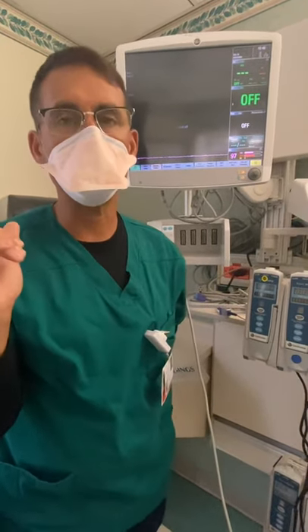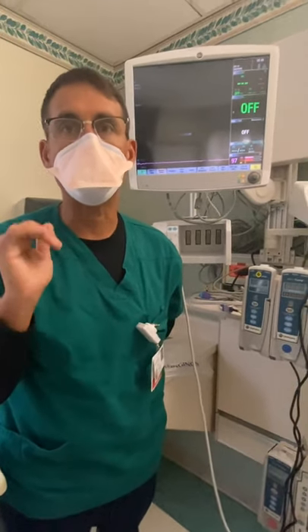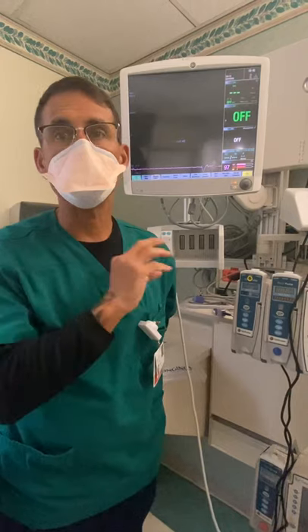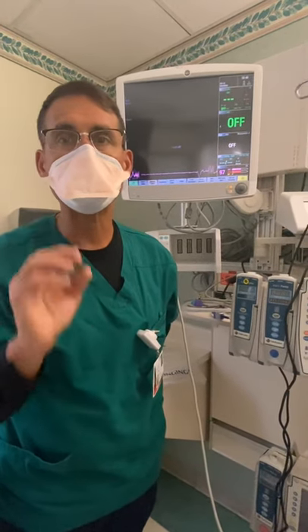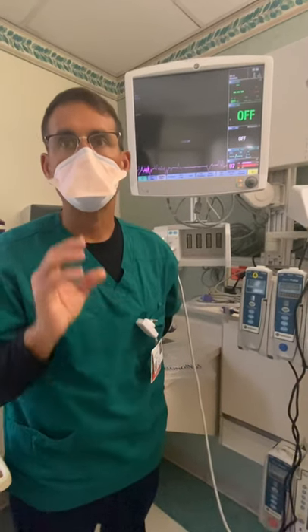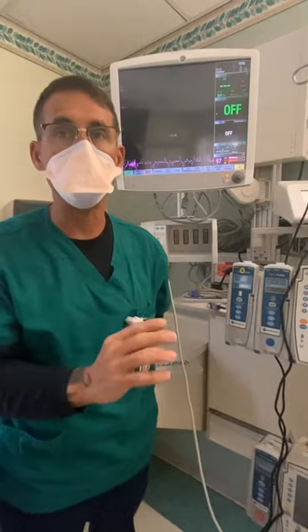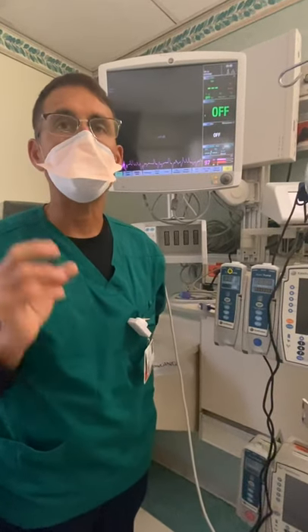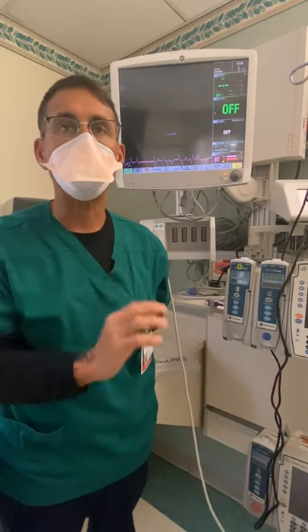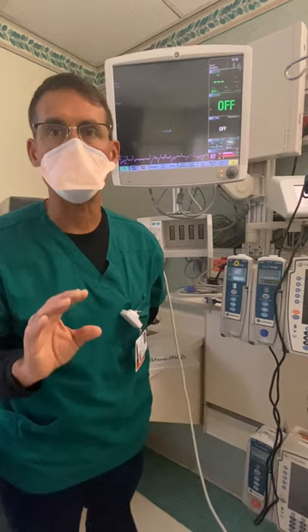Like I said in a video previously, if you have somebody on sedation, on paralytics, and you don't have a BIS monitor, you do not ever, for any reason, take away sedation. Please don't take sedation. I still have multiple patients this week, after we discussed this last week, that had sedation turned down while paralyzed. You do not have a need to do that. It's okay for them to be oversedated.